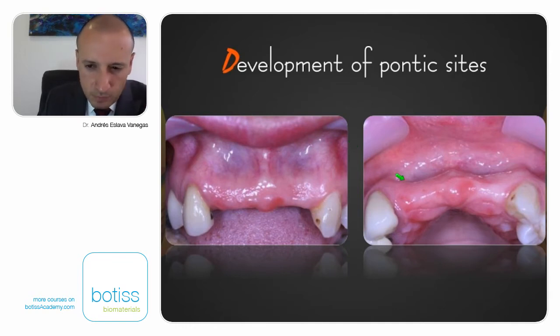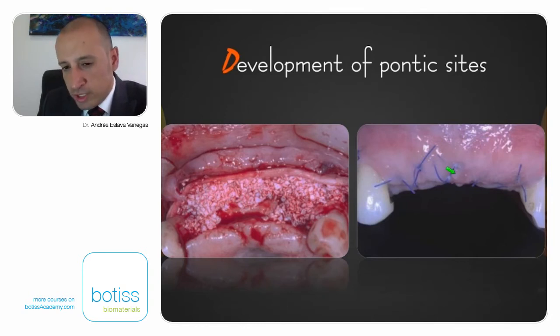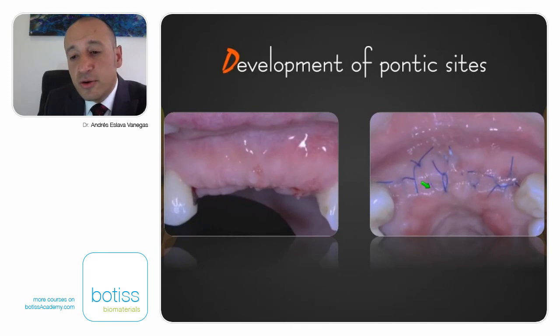So we have here Olga. Olga is a team, a staff team member from a colleague of mine, and she wants us to do something in here. She wants to have implants in here, but she has a very thin biotype and a huge defect. Okay, so we use again a dermal matrix graft, a xenograft mixed with autograft, and from this point to the end, we started to use growth factors. So you're going to see like this. This is 24 hours after the surgery, and you can see how it's healed. And look how this ridge is healing. And you can see here, there is a month after the surgery when we remove the sutures. You can see here. Okay.